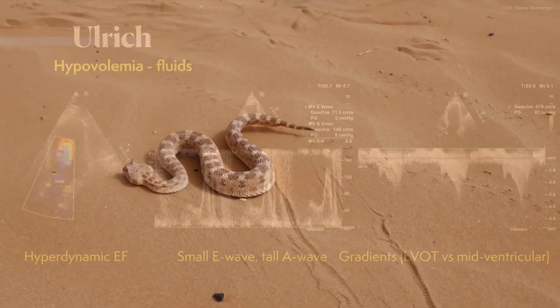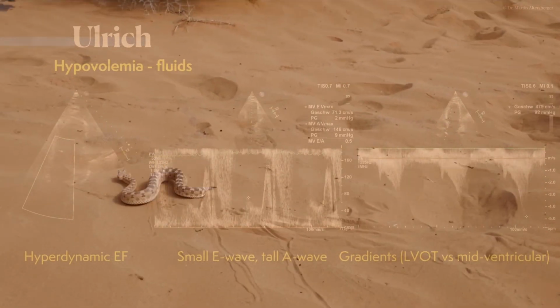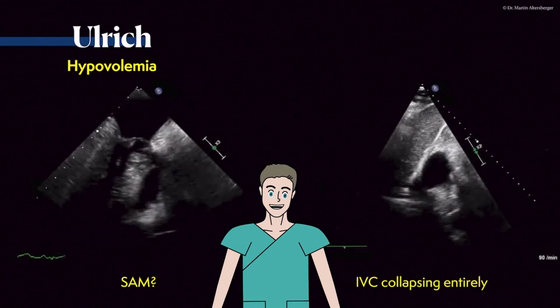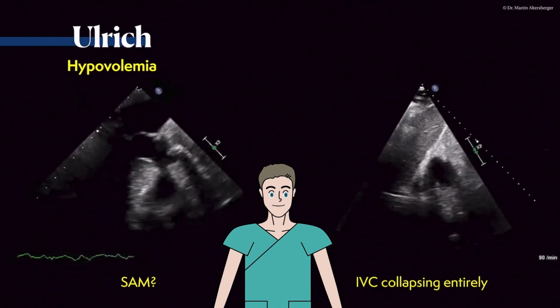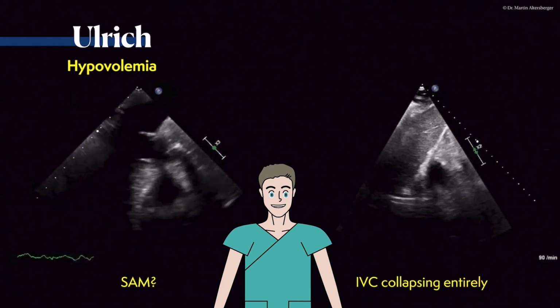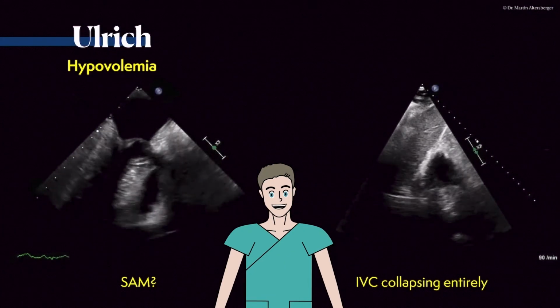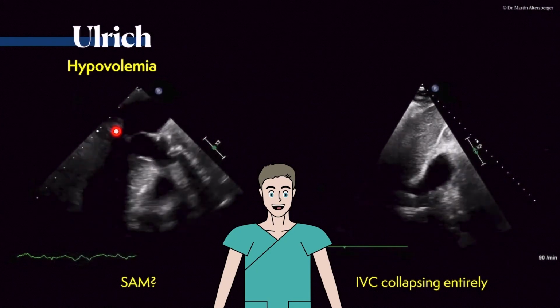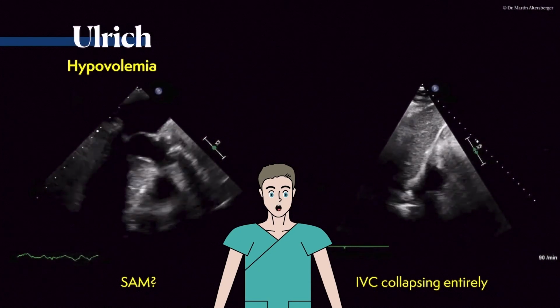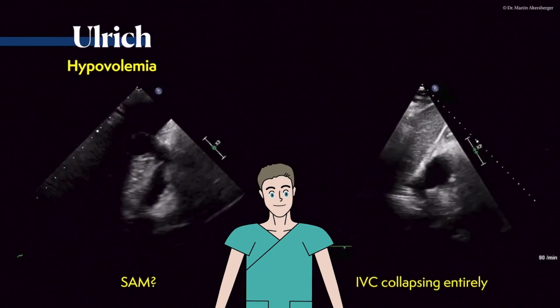And to summarize, Ulrich suffers from hypovolemia because of his previously discussed conditions. Continuing our exam, you see that the IVC is also collapsing entirely, and we even performed a TEE study. On the one hand, he also had infection, but we also wanted to make sure that there is no real LVOT obstruction present. Here you can see the mitral valve, the aortic valve, to a certain degree, looks calcified, and this is the interventricular septum.